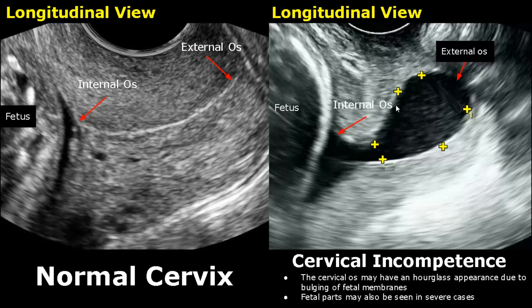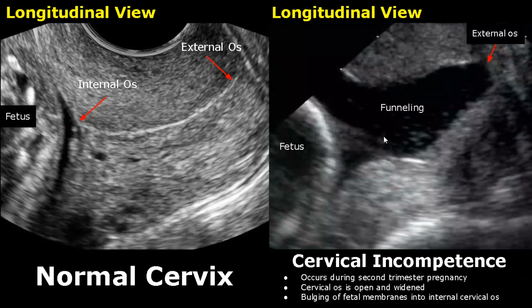It looks like this. In severe cases, fetal parts or even the umbilical cord may also be found in the cervix. Here is another image of cervical incompetence — this is the dilated cervix and this is funneling.